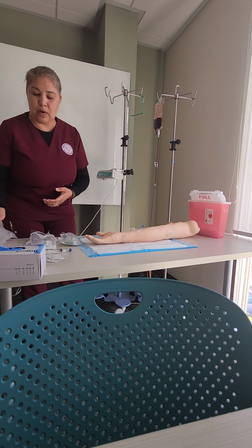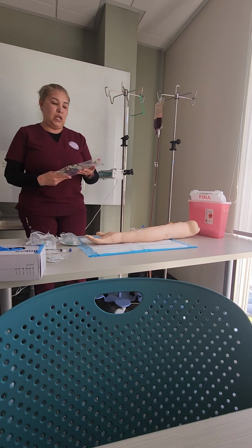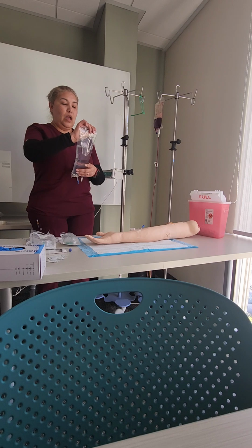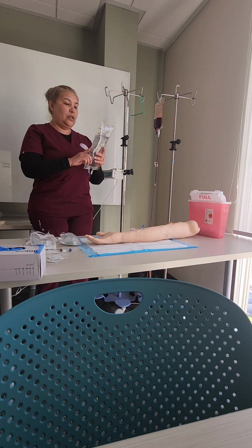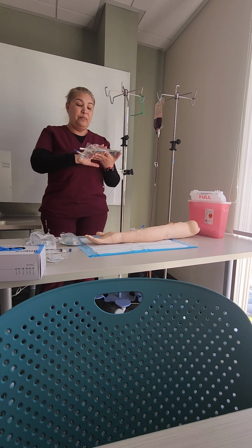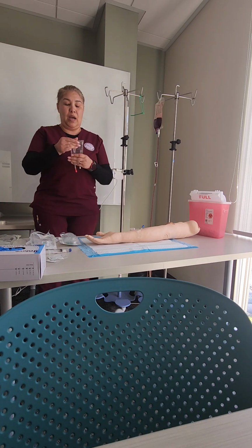First, I want to go ahead and grab my saline, which my patient will be receiving because she is dehydrated. So when I pull it from the Omnicell, I want to make sure that I have the right medication, that it is not expired, that it looks clear, and that my bag is not compromised in any way. So now that I know that it is ready, I know that I will also need to hang some antibiotics.